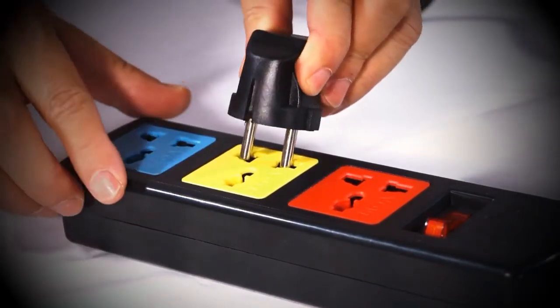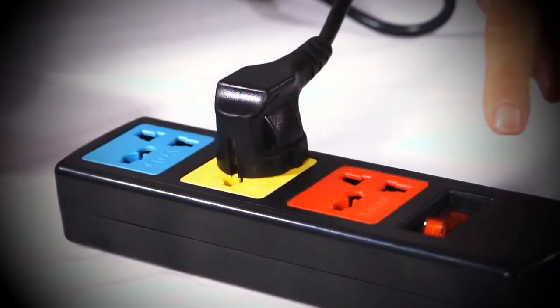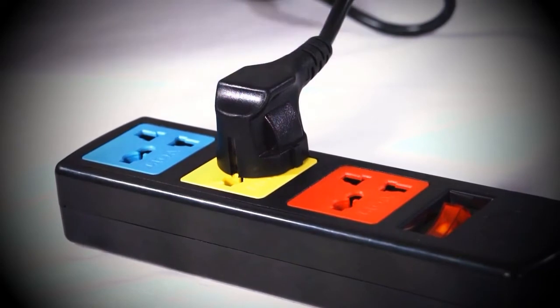Now you can plug the power cord into the electrical outlet. Make sure that the power cord is compatible with your electrical outlet before plugging it in. If it does not fit, please use an appropriate adapter.